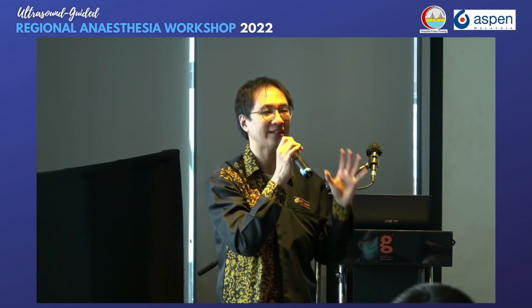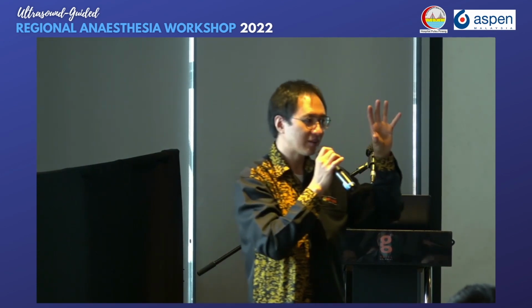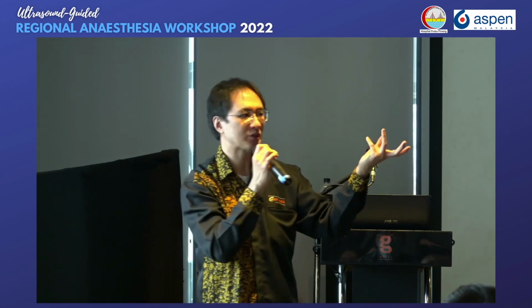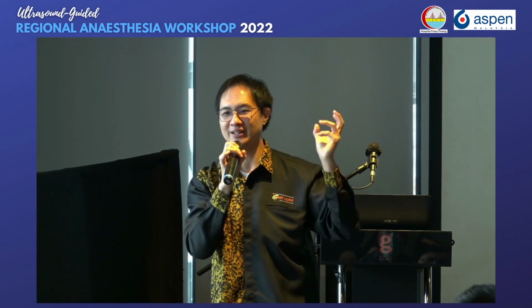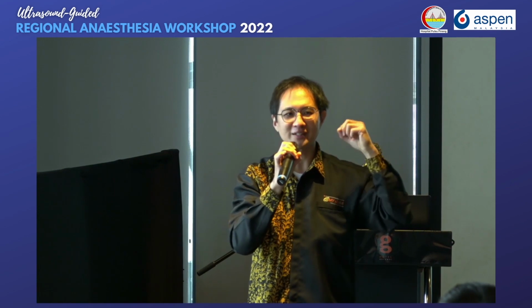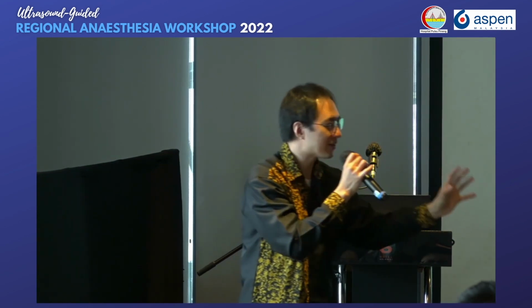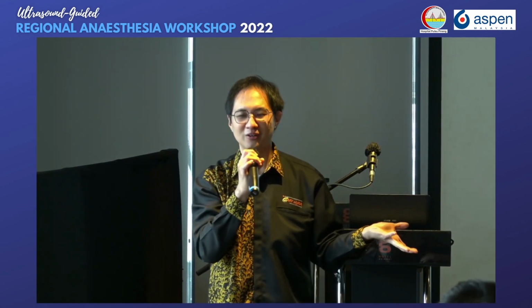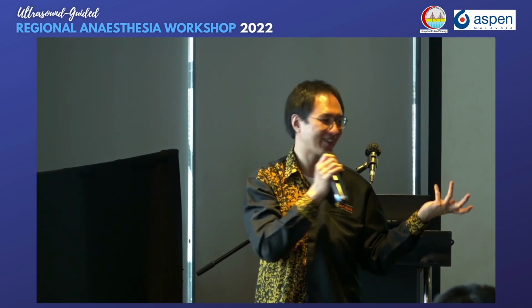So, for the popliteal, yes, again, back to the same thing. For popliteal sciatic nerve block, we need to have the background understanding that there is thick connective tissue surrounding it. So maybe you need to go a bit deeper. You need to puncture a bit deeper, not like the brachial plexus. There, you puncture a bit deep, the patient has pain already because you already touched the nerve. Maybe at the popliteal sciatic, you need to puncture a bit deeper. But you really cannot see the epineurial sheath. Okay. All right.